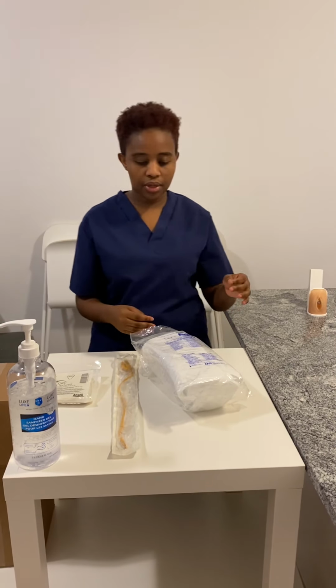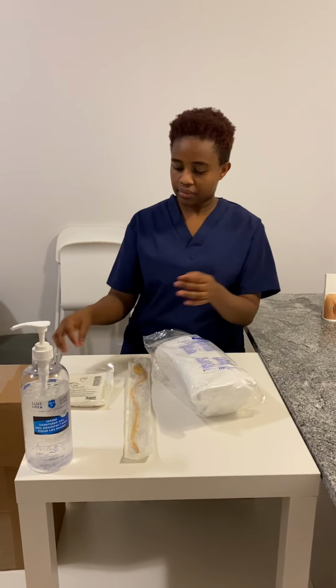So now I'm going to open my tray. And before opening my tray, I have to make sure that my client is in a good position before the procedure.